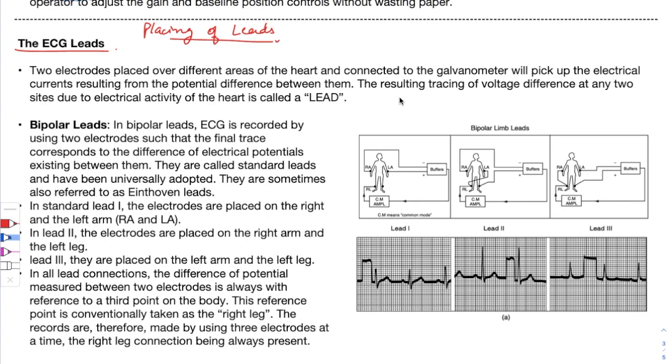The resulting tracing of voltage difference at any two sites due to the electrical activity of the heart is called a lead. So that is the definition of lead.